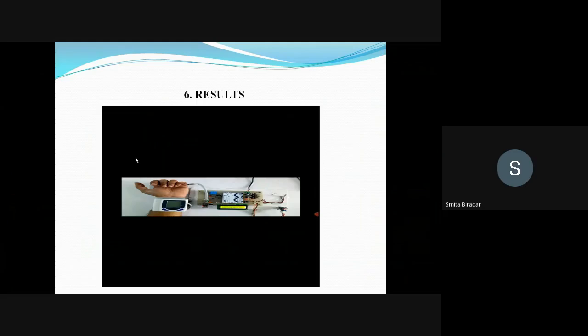That's IoT. We are using IoT in this project for saving all our patients' information in a cloud. That's, according to the developers, ThingSpeak. That is an app we are using. ThingSpeak is an open source Internet of Things application, and it stores the relevant data from the things using the HTTP protocol over the internet via a local area network. ThingSpeak enables the creation of sensor logging applications.